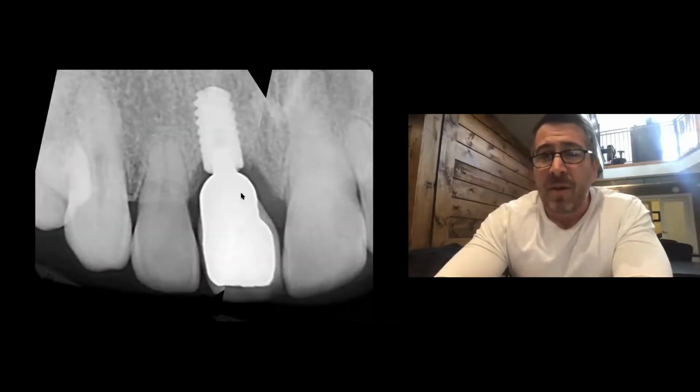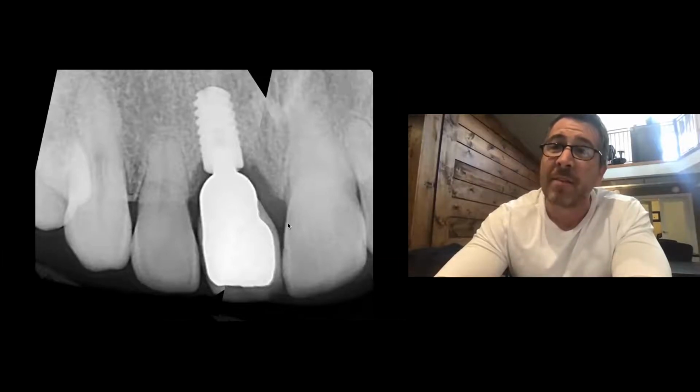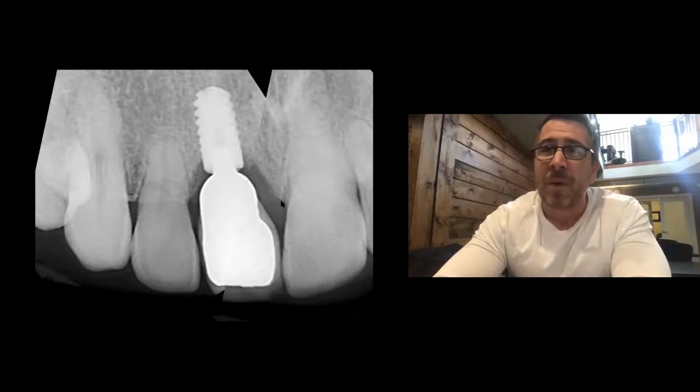So there's the radiographs. We're looking at the interdental height of bone. So now we said on average the papilla would be 4.5 millimeters. I'm going to say that from this point of bone to this contact is more than 4.5 millimeters. Well, how can that be? That can only be if he's got a bit of a pocket here. So he also has a little bit of perio. So I measure the interdental height of bone off the x-ray, but I also pick up a perio probe and I go around the adjacent teeth to see if there's a pocket.